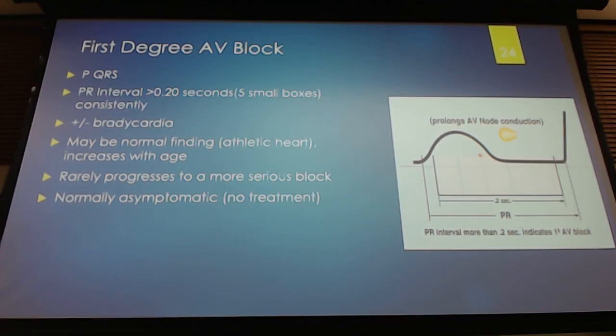Or you could just send, some places they'll allow you to send the cardiology folks an email with the ECG and say this person came in for a routine evaluation, they have no other signs or symptoms, do you have any recommended additional evaluation for this patient or just monitoring? But even though for most of them there's nothing to do, you want to make sure that, especially in the active duty population, we talk to somebody about this at some point. Not emergently, but routinely. Right, so prolonged PR interval, not specifically PR segment, but the whole interval is prolonged.